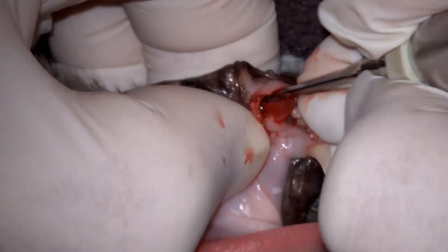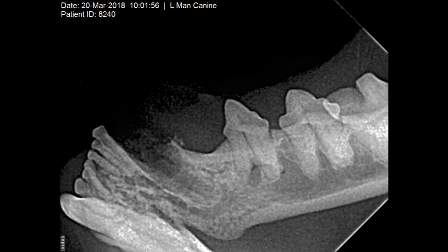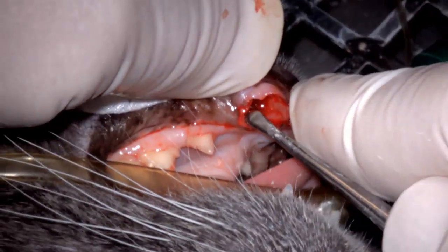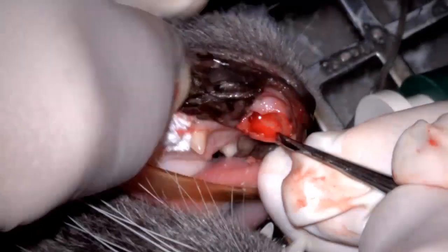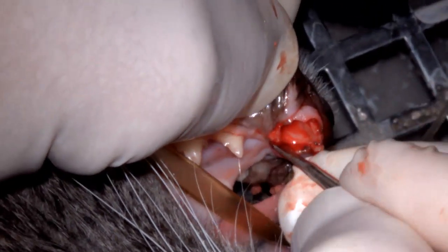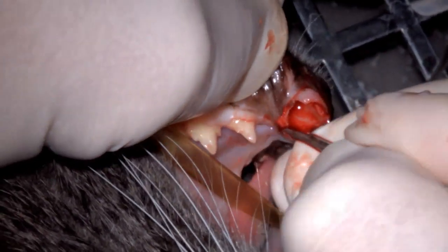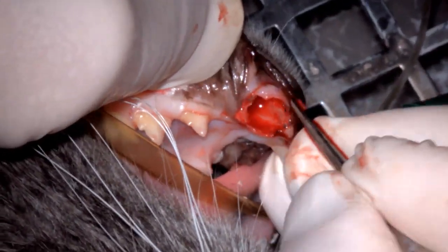When the root tip is being broken down by chronic inflammation, resorption, and ankylosis, it can be difficult to know for sure when all root is gone. But looking at this post-operative radiograph, I was satisfied I had removed everything needed, and it was now time to debride the socket of any remaining fragments or loose floating debris, make sure it filled up with a good blood clot, and start closing the wound. This involves reflecting the flap a bit more, making sure we can get good tension-free closure, undermining the flap a little more on both labial and lingual sides. I like to keep flaps conservative initially and then undermine for closure at the end — this means less debris under the flap and less bone exposure becoming desiccated during the procedure.